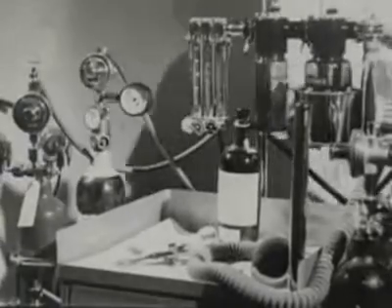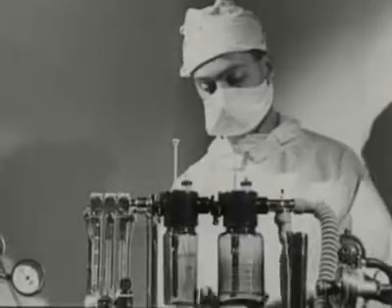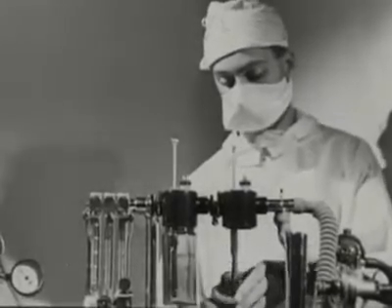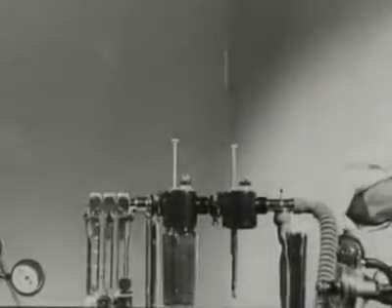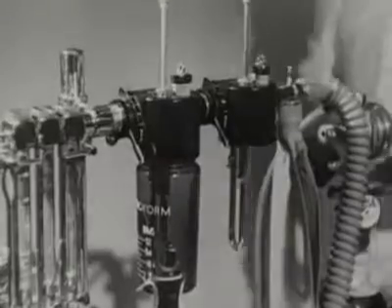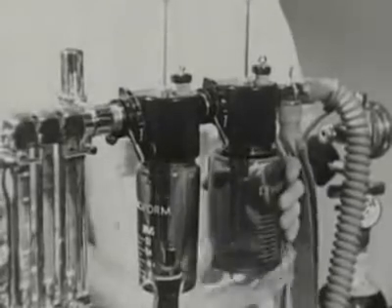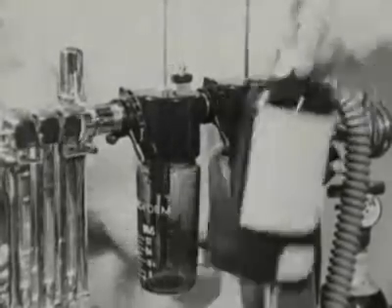Ether decomposes in sunlight and in the presence of oxygen into poisonous aldehydes and peroxides, and it may become contaminated with chloroform if this has been used in the other bottle. If you are in any doubt, pour it away. In any case, the ether bottle should be emptied not less than once a week and refilled with fresh ether from the stock bottle.